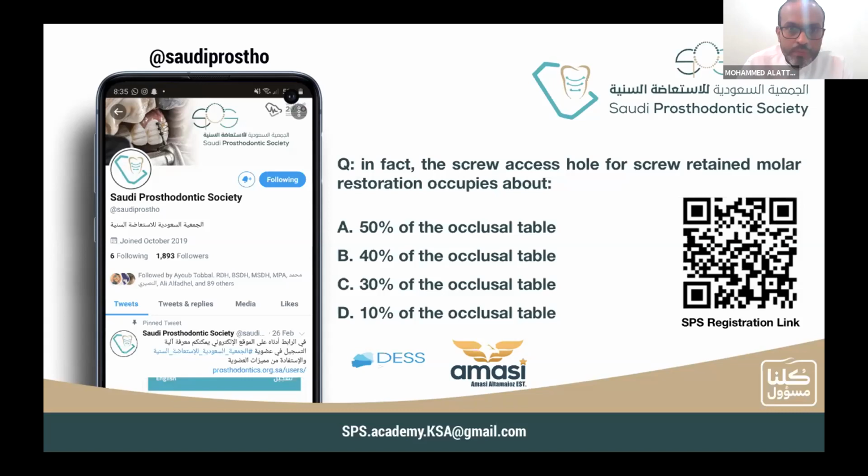Which information should we provide to get the Duralay that is shaped like teeth? And at which step should we ask for it? This is a nice question. Most of the time we are concerned about the thickness of the porcelain. We are not caring about the thickness of the metal or the substructure that we need. We need to know the thickness of the metal that we need.